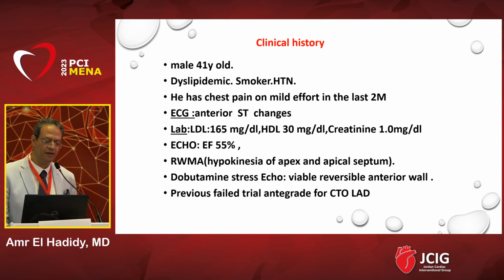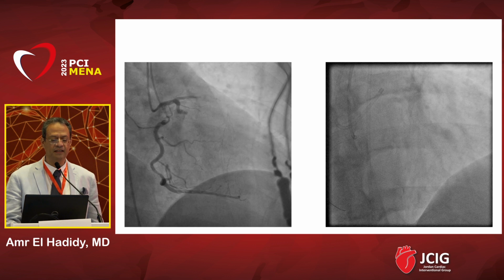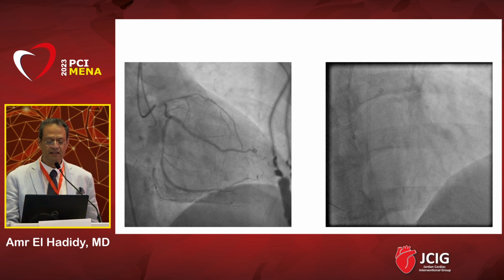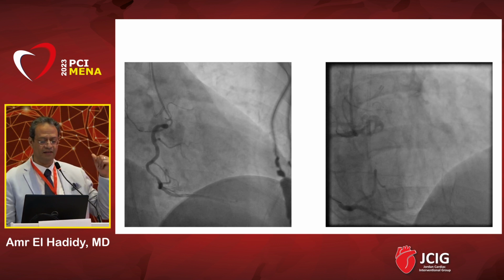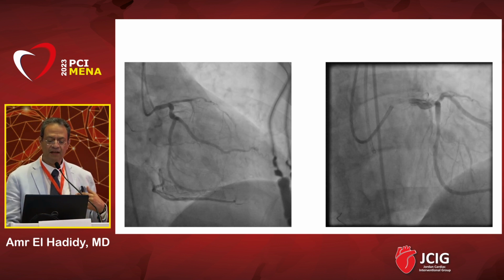This is another example of a retrograde case with a CTO of the LAD, and there are good septal collaterals coming from the RCA. This is a different scenario than the other case with epicardial collaterals. This is septal, and then you try to connect.